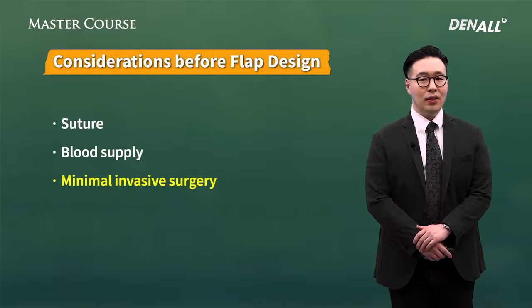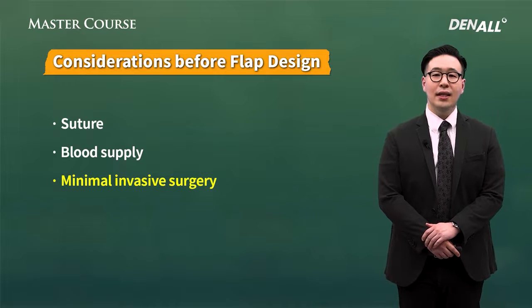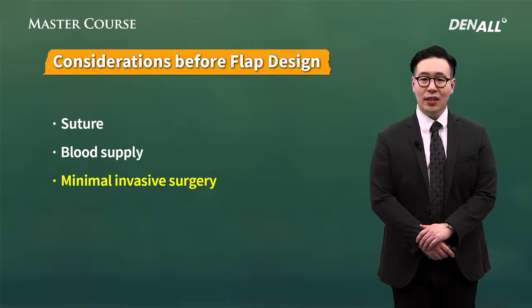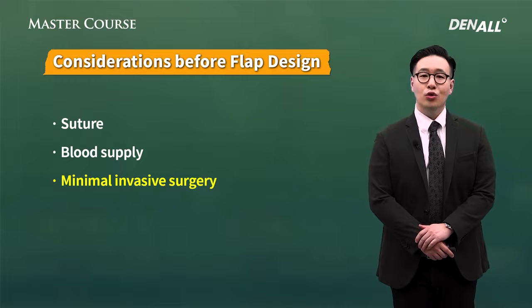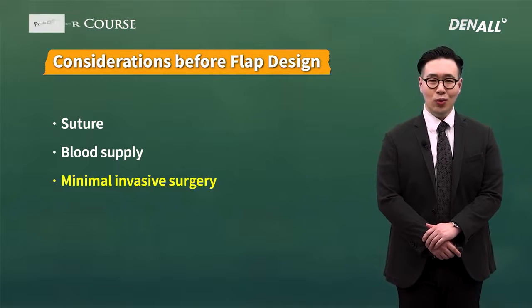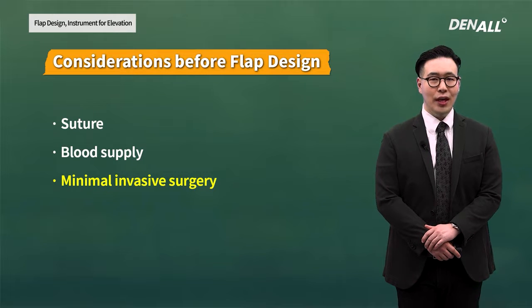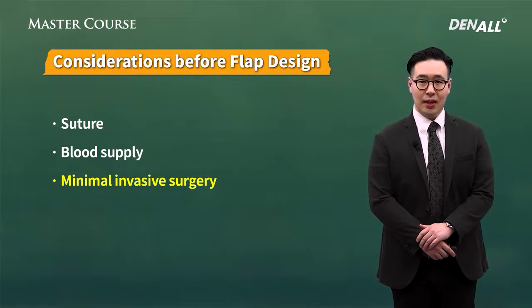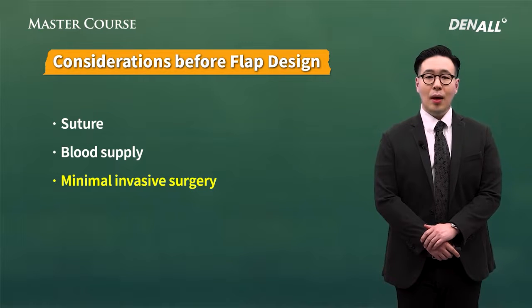Flap elevation is the starting point and the end point for perfect surgery. If you make incision in the wrong position, no matter how advanced your technique is, it will affect the prognosis and healing. And I would like to say that you need to open flap thinking of how you're going to close it.